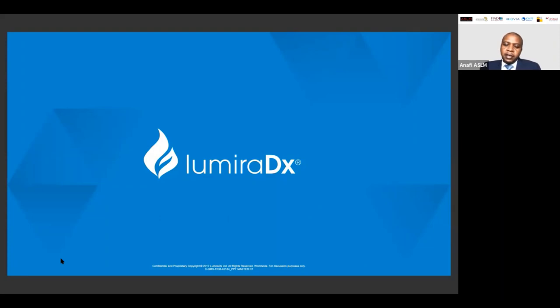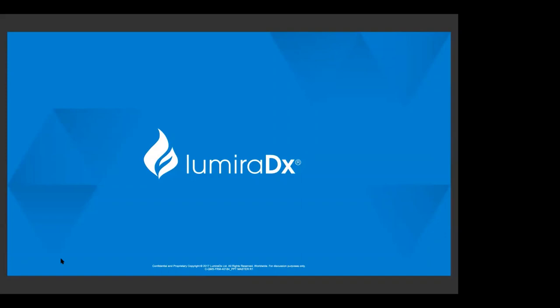Diane Waku, I think he or she has tried to come back to the question of controls that I asked earlier, and wants to know, do you have to run these controls in parallel or for each sample, or is it a separate run? How exactly does it work? Okay, so the system has many built-in controls. Each time the instrument asks for the test strip, it's already running multiple controls on the system. When the sample is run, we use microfluidics. So at each step of the testing process, the instrument and the software are making sure that the liquid is where it's supposed to be, et cetera. So it's got lots of what we call error traps built in to make sure that there's never a result reported back that's due to some issue with the way that the sample has run on the strip. So there's always lots of controls and testing happening every time a sample is being run on the strip.